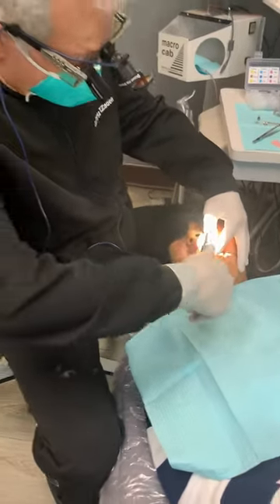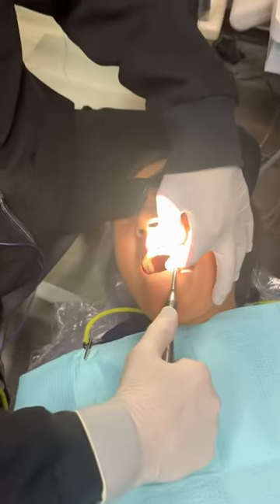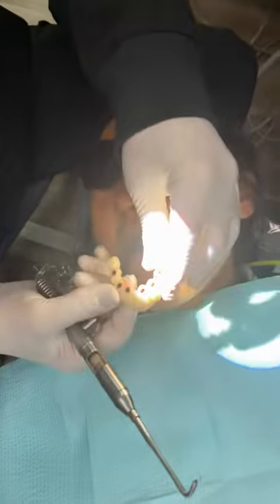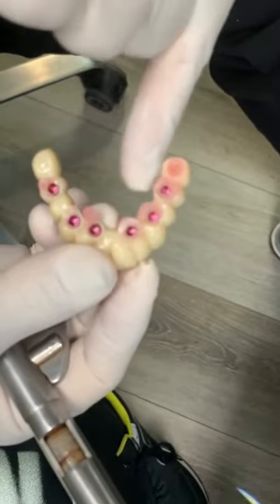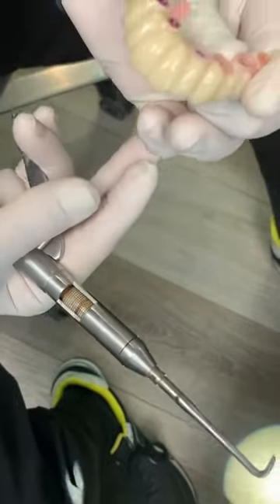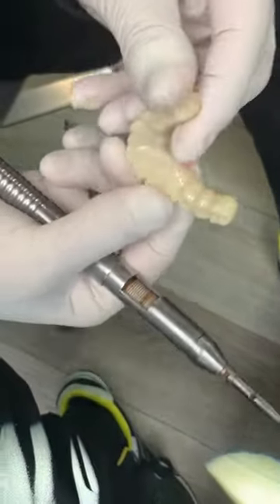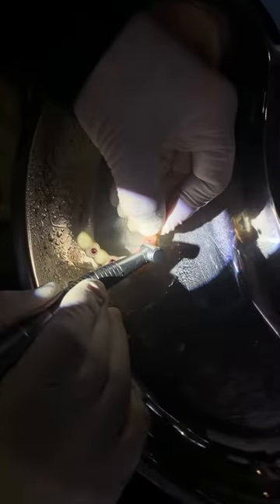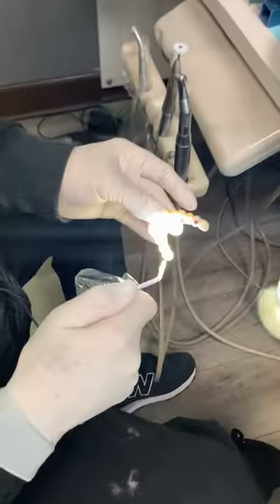It's a very loud noise. So now all we have to do is trim these and put them back in. That's a full zirconium — no screw holes and no cement, because once this goes in and we tap them in, that's it.